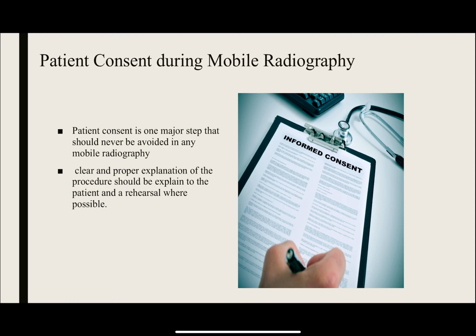Next we are going to talk about informed consent. When we talk about mobile radiography, we are practicing it outside of the diagnostic radiology department. We mainly do this kind of mobile radiography for patients who are physically not fit for transport, or who are terminally ill. And for this we must never forget informed consent before doing mobile radiography.